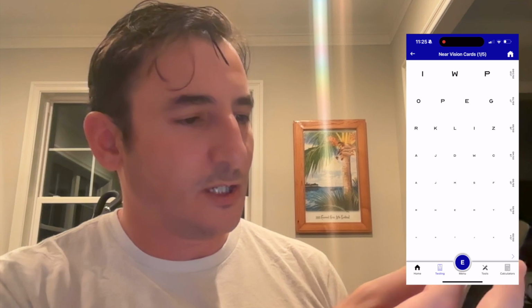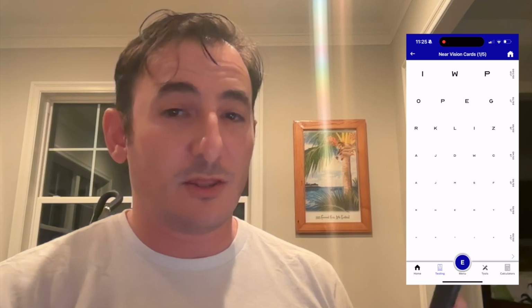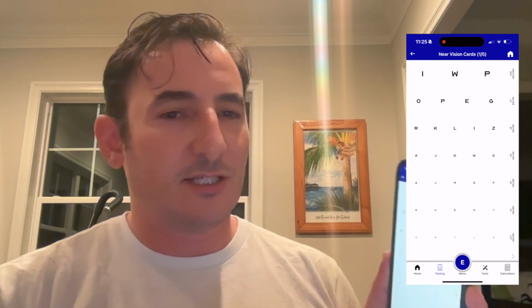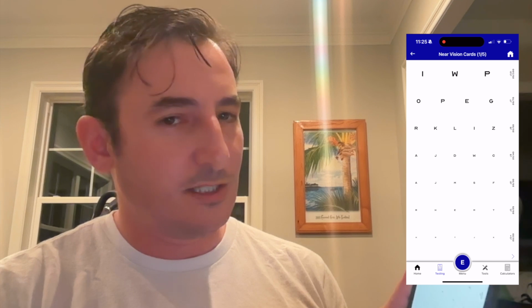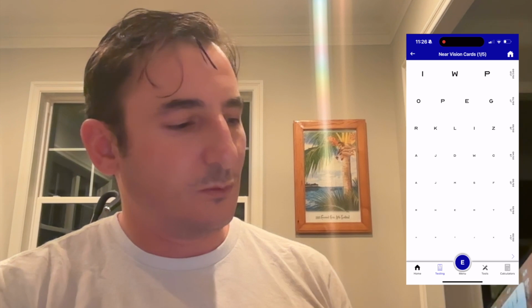But for me, for the 20/100 line, I get about 4 millimeters in height, and for 20/100 it should be less than 3 millimeters. It should be about 2.75, 2.8 millimeters. So in reality, if this is 4 millimeters, you're really testing 20/150. So the accuracy isn't perfect with the near vision on this, but it's pretty close. It's decent for screening.